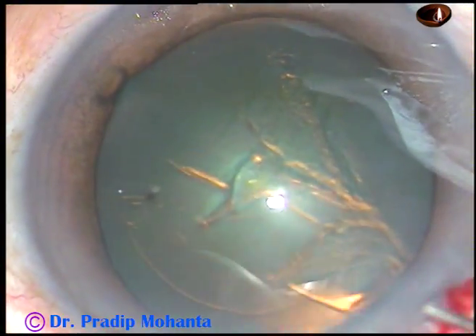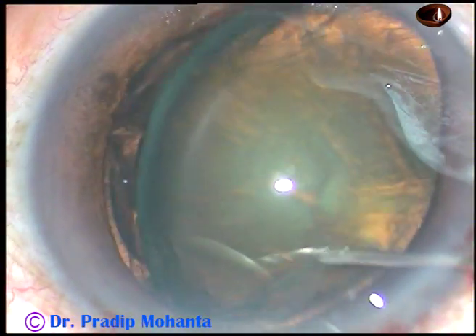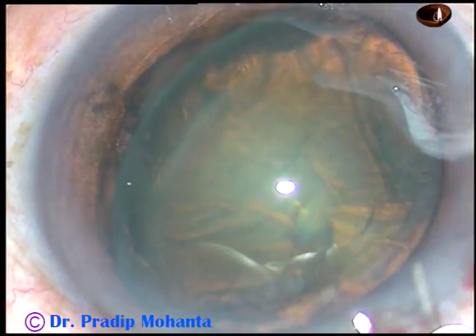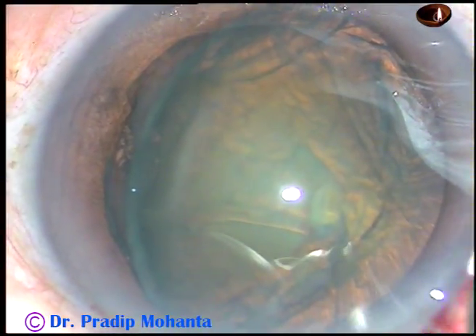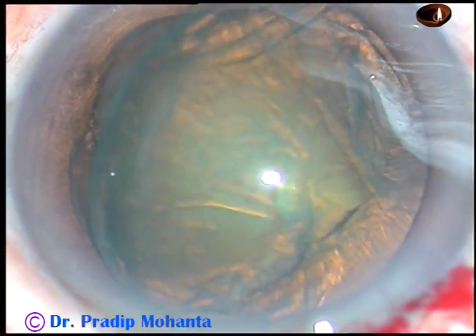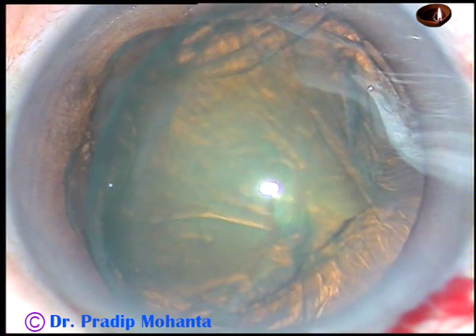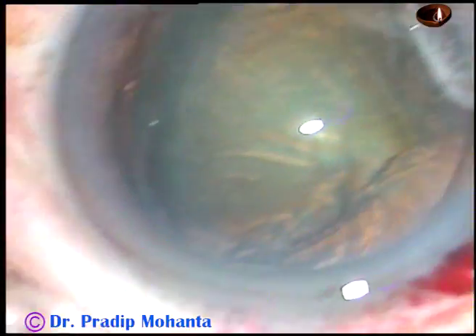Now, hydrodissection. As I do hydrodissection, the whole lens tilts, and it stands on its equator — the lower equator rests on the posterior capsule.